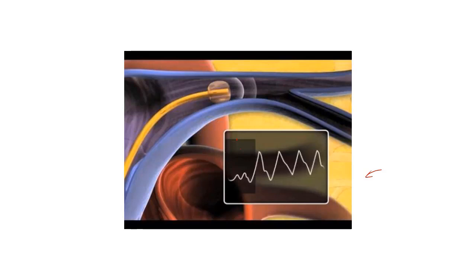So here they just deflated the balloon. If you deflate the balloon, you're going to see the PA pressures again. They drew back, reinflated, and re-wedged, and you see the wedge pressure again. Now they're deflating the balloon as we would normally do to maintain it, and you see the PA pressure tracing again.